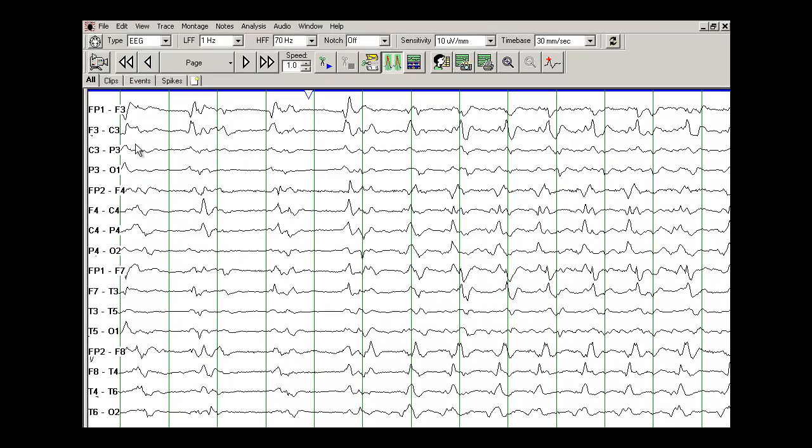Just for your recollection, odd numbers record from the left side of the brain and even numbers record from the right side of the brain. So what do you see on this EEG?